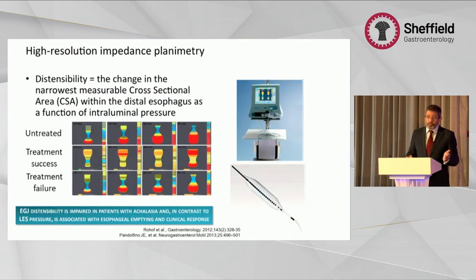Another tool that is very nice to use, but is expensive, is EndoFLIP, which can measure both distensibility and compliance within the esophagus and lower esophageal sphincter, especially if we're trying to define subtle obstruction that is not mucosal or macroscopically visible. And it is a very nice tool, but it's expensive. It's not used widely in clinical practice in this country.